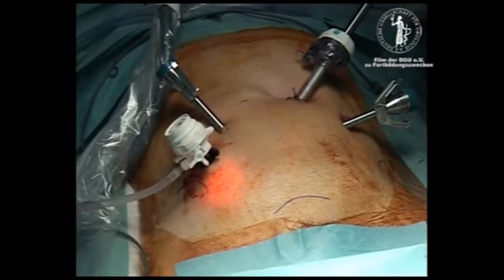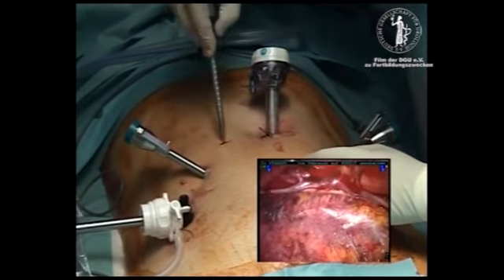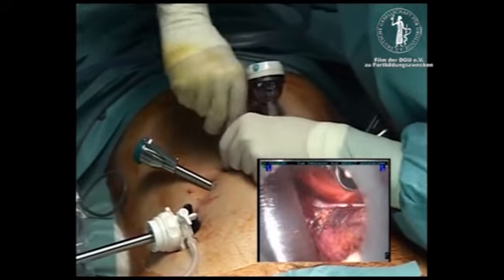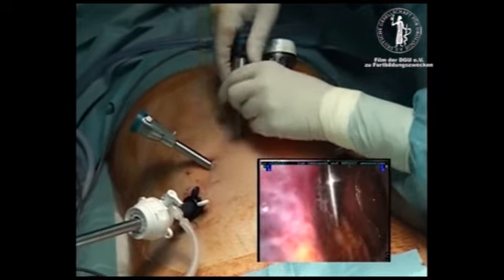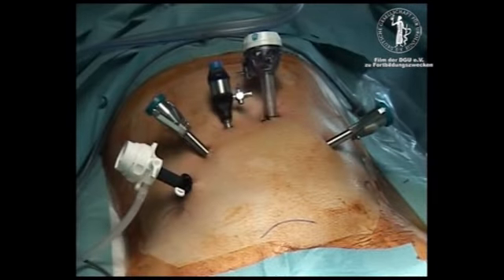To assist in this placement, the camera is transferred to the 12 mm assistant port, where the visualization of the camera trocar and the 5 mm port insertion is possible. Here is the final port placement.